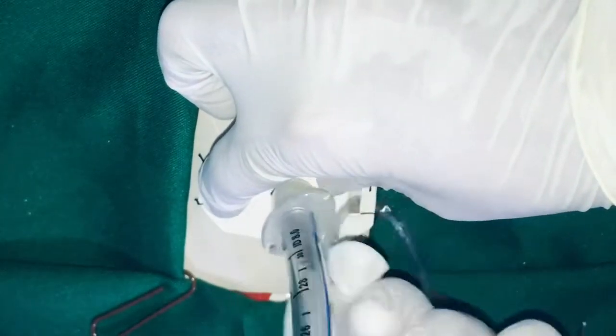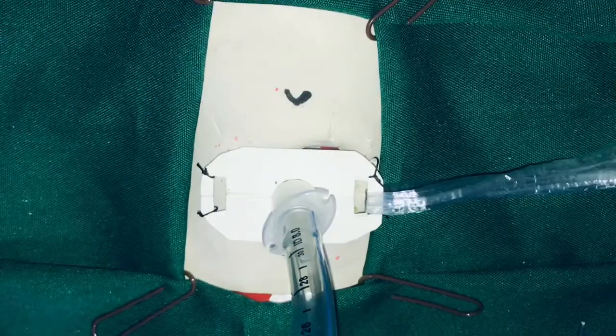Further secure with tracheostomy tube ties but not placed too tightly.